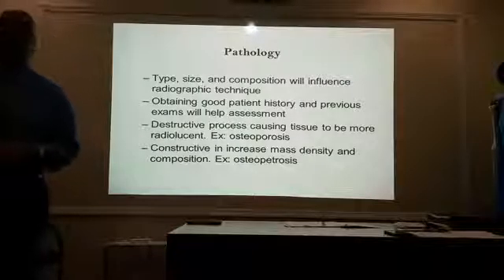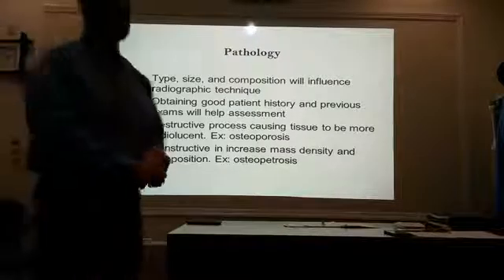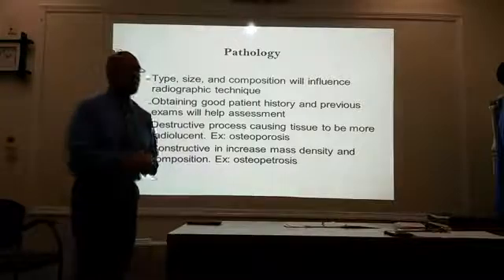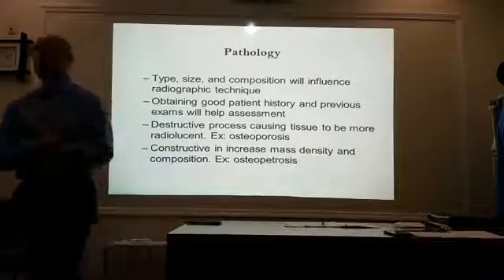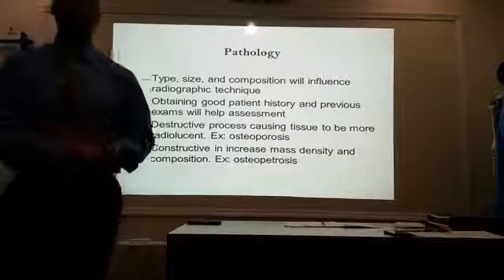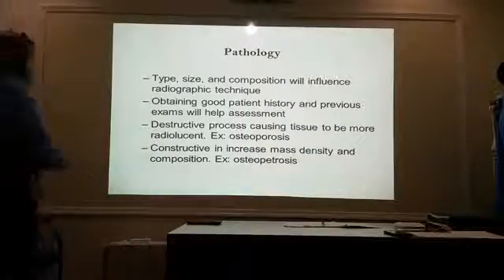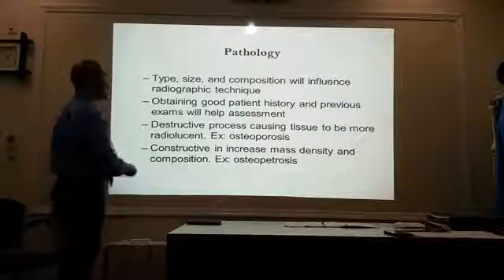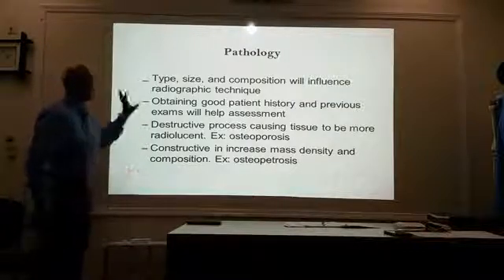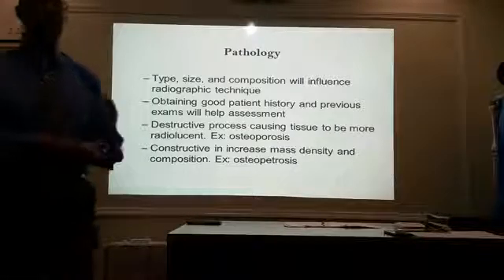All right, pathology. It's not so much that we understand our patient's size, what part we're going to x-ray, and the composition of the part we're going to x-ray, but we also need to have knowledge of pathology. Type, size, and composition will influence the radiograph. However, getting good patient history on why they are here to get an x-ray done helps.